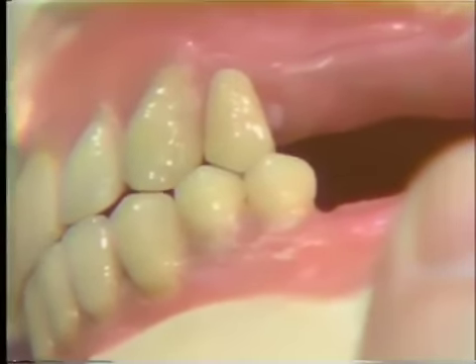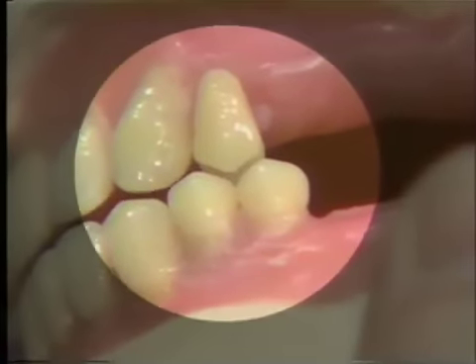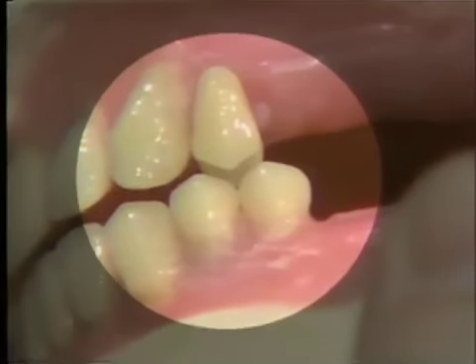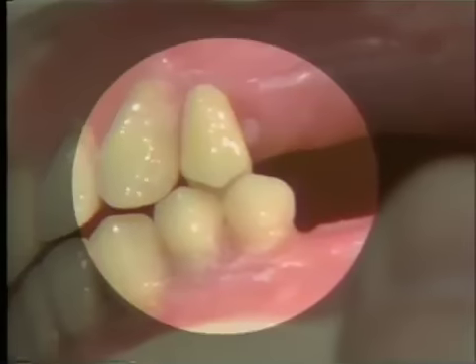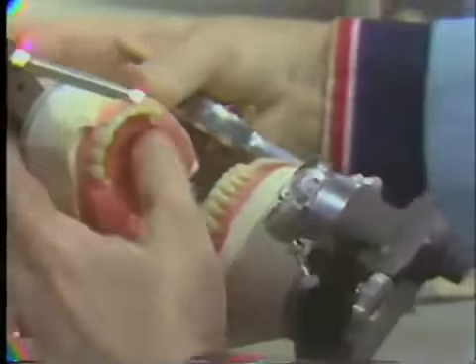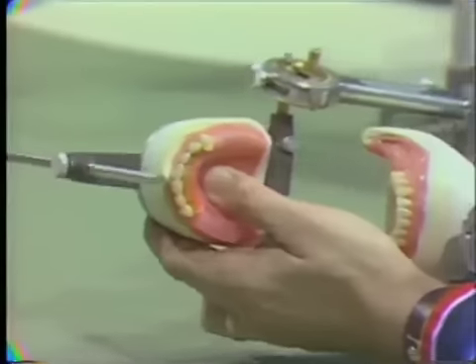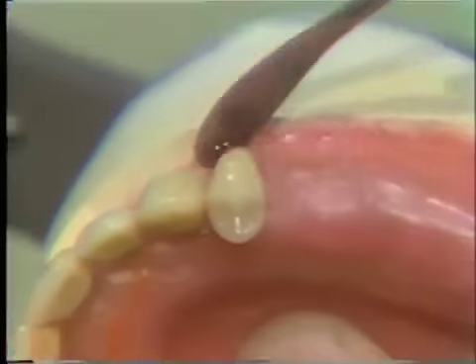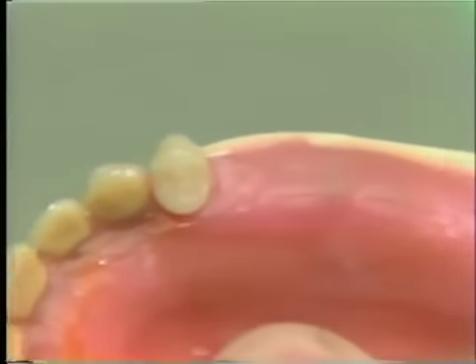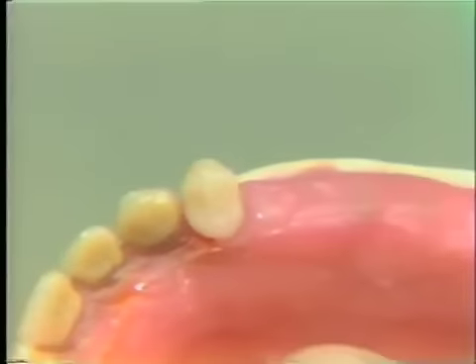See how the cuspid is clearing through — that's what we want to do. Sometimes this has to be done by grinding the surfaces of the tooth, but we try to come as close as we can by just setting the teeth. Now that is fairly close, so I'm going to place that into position by putting a little more wax around the tooth itself, just enough to hold it. Then I'm going to go ahead off camera and set the next two lower teeth — the molars — and then we'll try to set the rest of the maxillary teeth so that they balance.